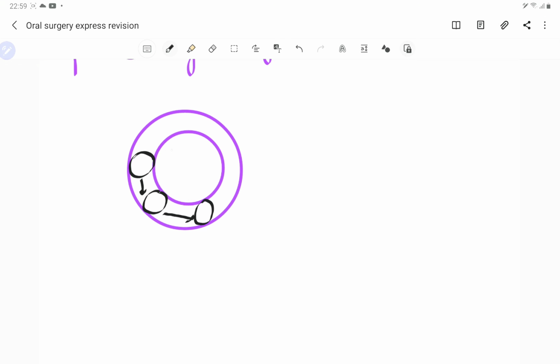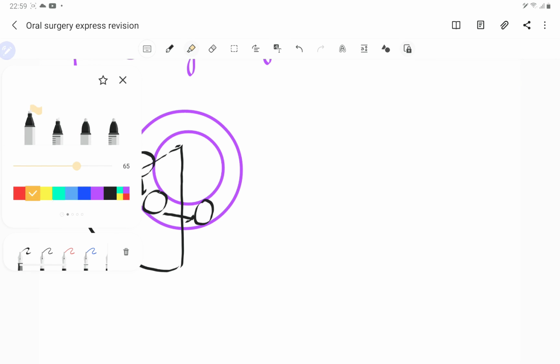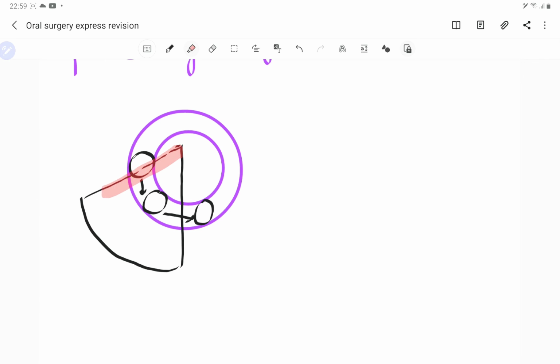So if we take only this much cross section, this is the exact principle which is used in the compression plates. This is the particular kind of movement which takes place in the compression plates, and this is how both the fracture fragments are pulled together towards each other.